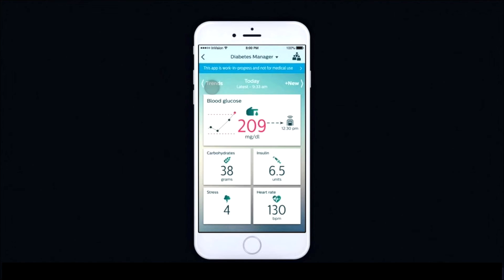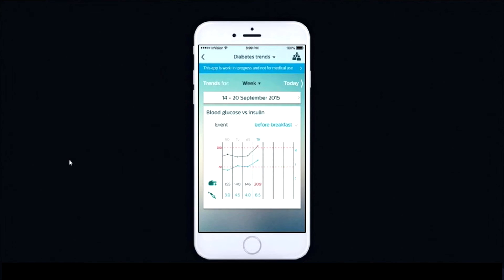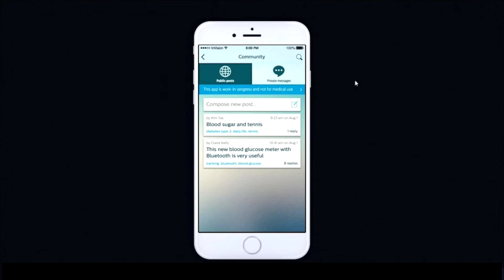They save that and get a summary on the summary view. They're able to see their trends over a day, week, month, or the time period they choose, to be able to see the relationships and their different values over the days.